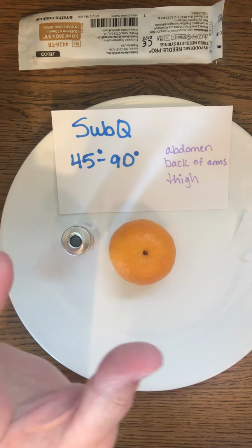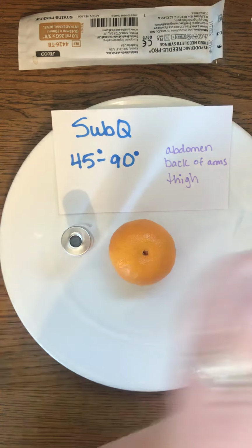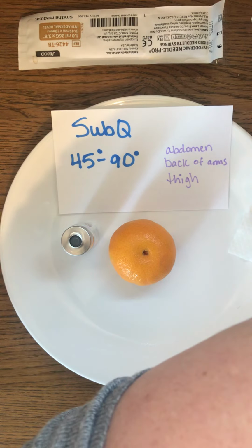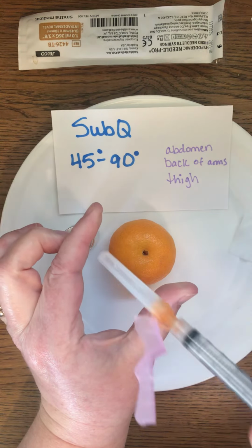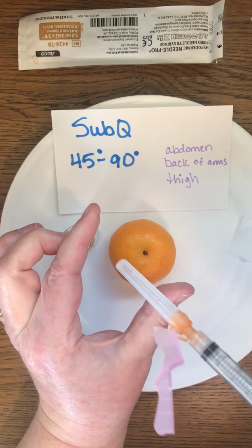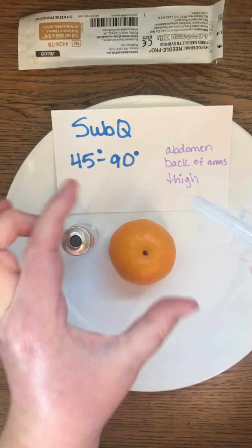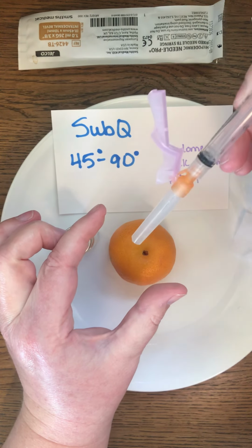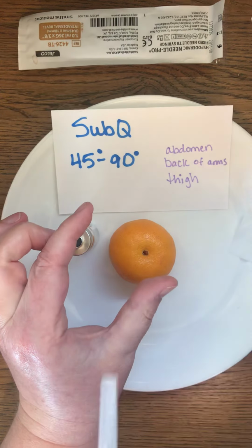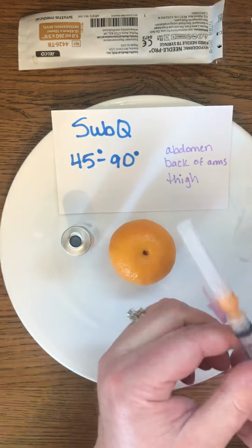And again, you remember when you are pinching the skin, you're going to want to make sure that when you give the injection that you are not pinching the skin and then injecting this way, because you may actually go through that person's skin and poke your finger on the other side. So once you're pinching the skin, you're going to want to give the injection like this. So then you don't have that chance, or like this if that works for you. But you want to have good control over that and not poke yourself.